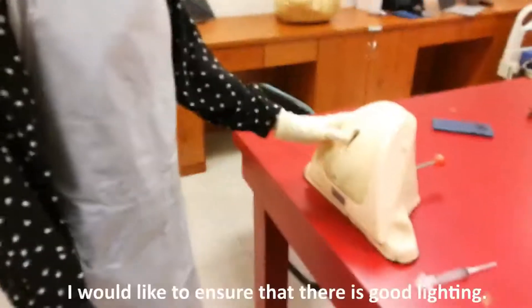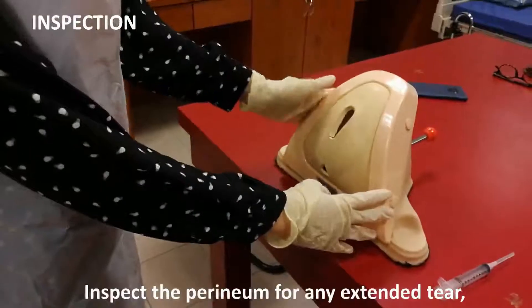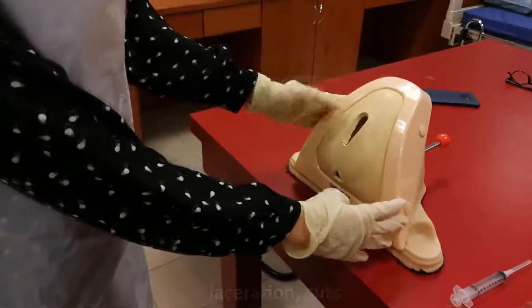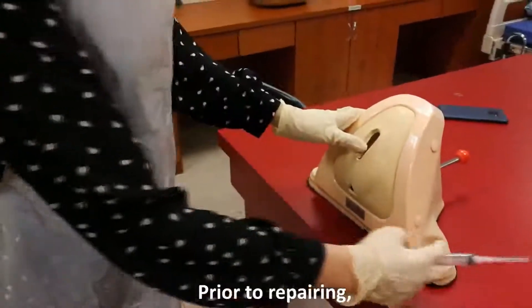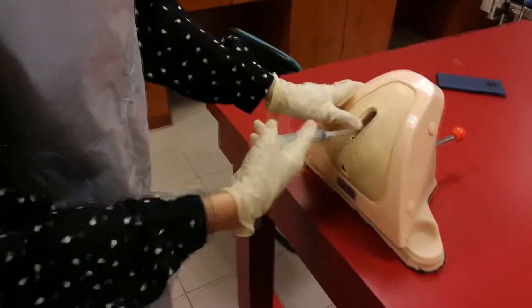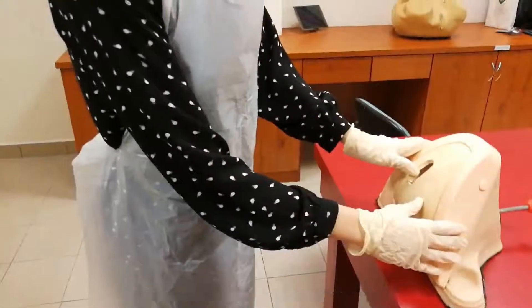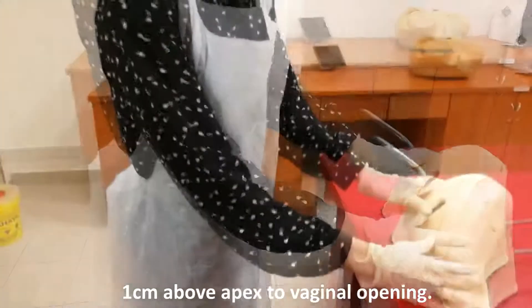Before that, I would like to ensure that there is good lighting. I will inspect the perineum for any extended tear, laceration, cuts and identify the apex. Prior to repairing, I would also like to inject local anesthesia into the perineum skin, perineum muscle and vaginal mucosa. I would like to start my repair one centimeter above the apex to the vaginal opening.